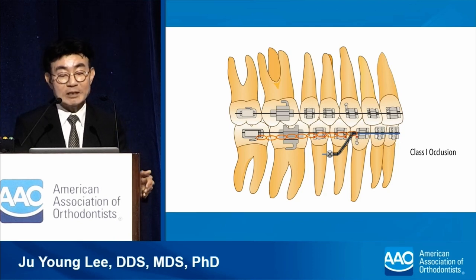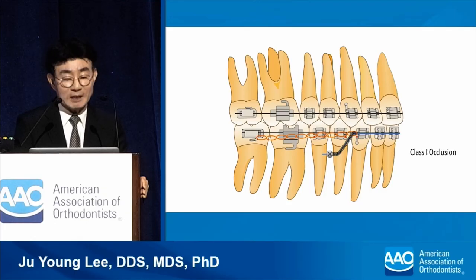By adjusting the amount of open coil spring, the position of the canine and anterior teeth can be adjusted forward or backward at any time. While maintaining the vertical stability of the mandibular anterior teeth, the posterior teeth can be moved forward effectively.